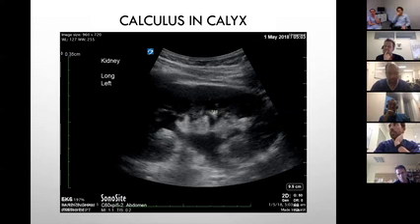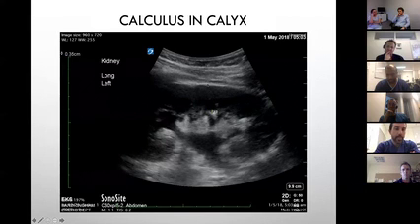Anything else? Is it because the pelvis is more echogenic and obstructs the shadow? I'm making it up, but if it is a shadow, it needs to go all the way down. It doesn't matter what the structure here is, because you're not seeing that structure. That means the sound has gone through that, isn't it? Technically, in that line of sight, you should not be seeing anything from that. You're seeing this structure. That means there's no shadow. Anyway, that's not the thing.